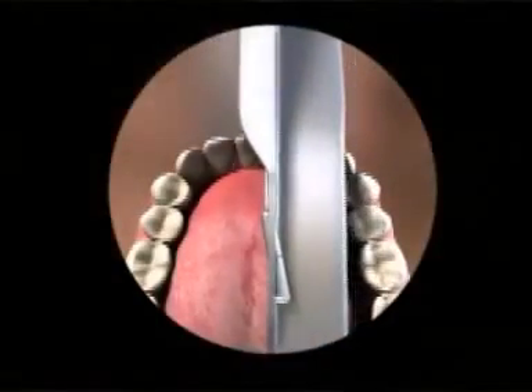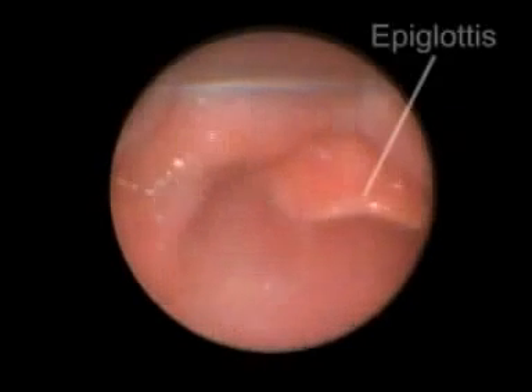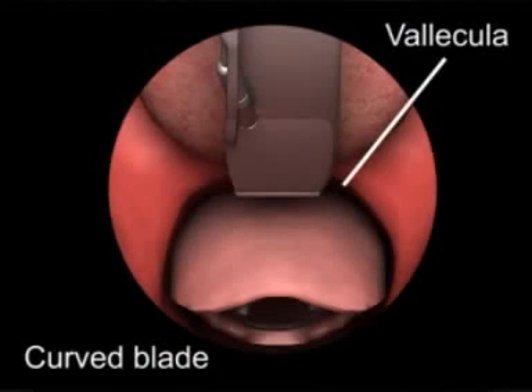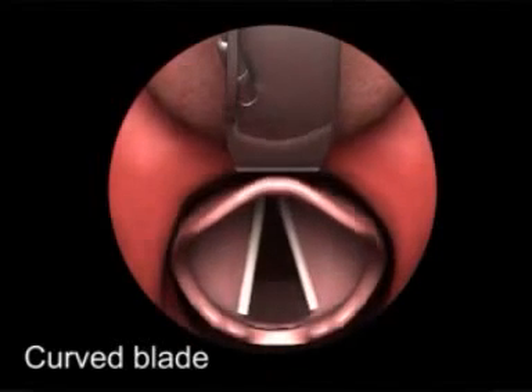Gradually move the blade to the center of the mouth, pushing the tongue to the left. Visualize the epiglottis. Ideal placement of the laryngoscope blade depends on whether a curved or straight blade is used. Place the tip of the curved blade into the vallecula between the base of the tongue and the epiglottis, and lift anteriorly to expose the vocal cords.